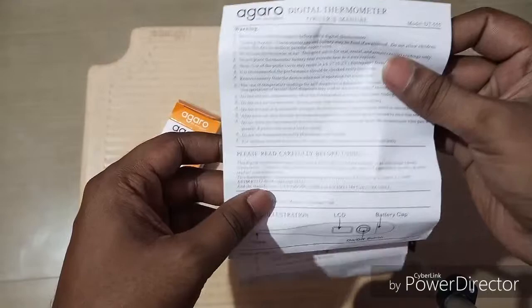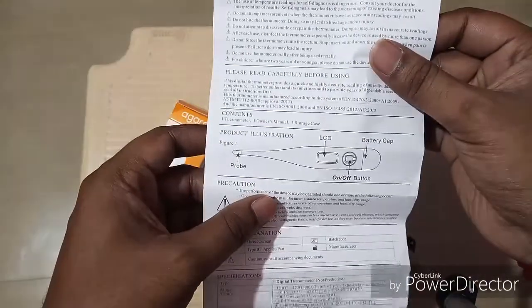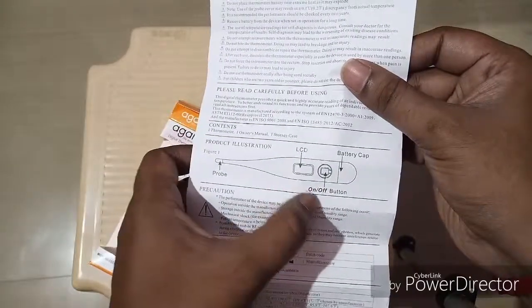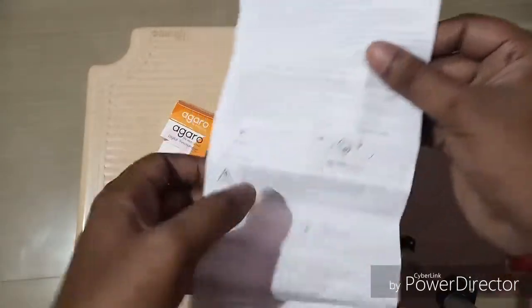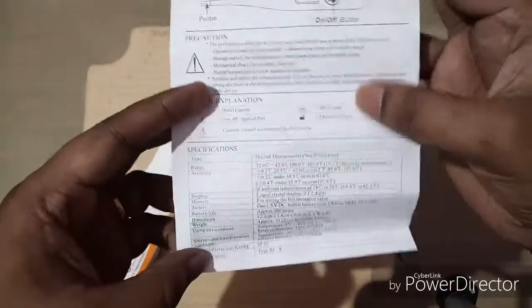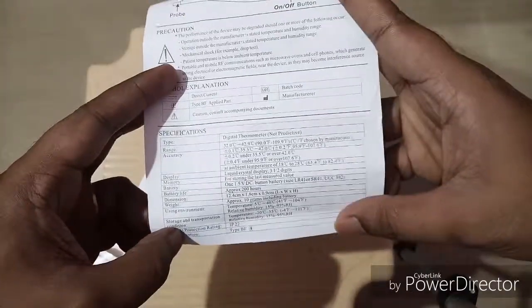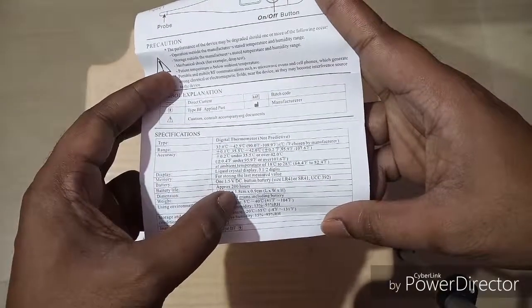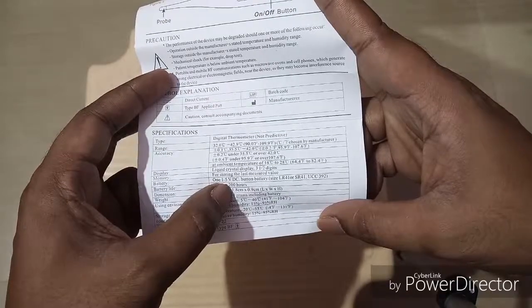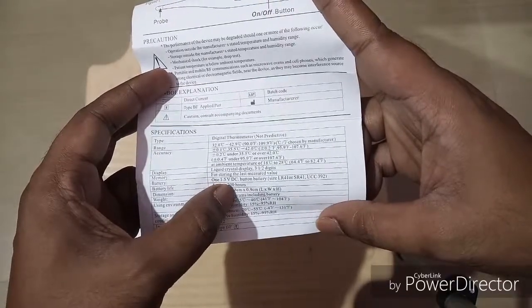The manual says 'Warning: please read carefully before using.' The product has a probe, one LCD monitor, one on/off button, and a battery compartment. Precautions and specifications are mentioned. The battery life is approximately 200 hours and it uses a 1.5V DC button battery.